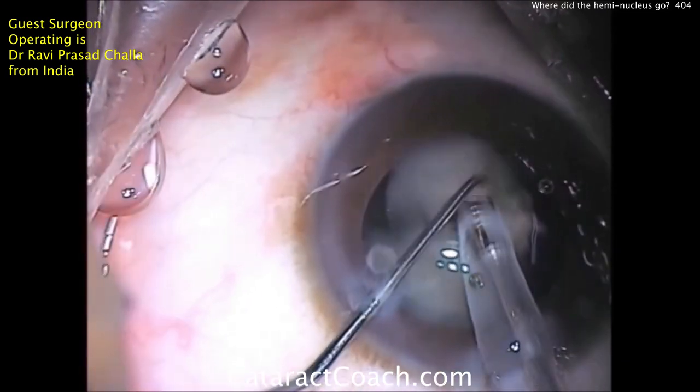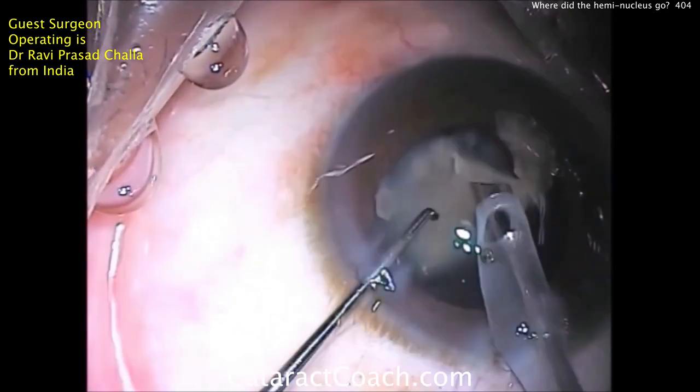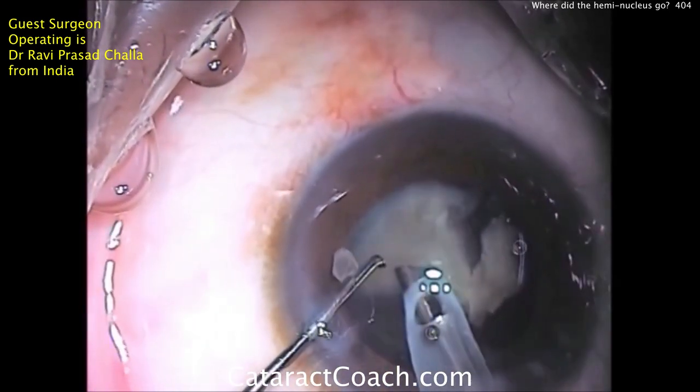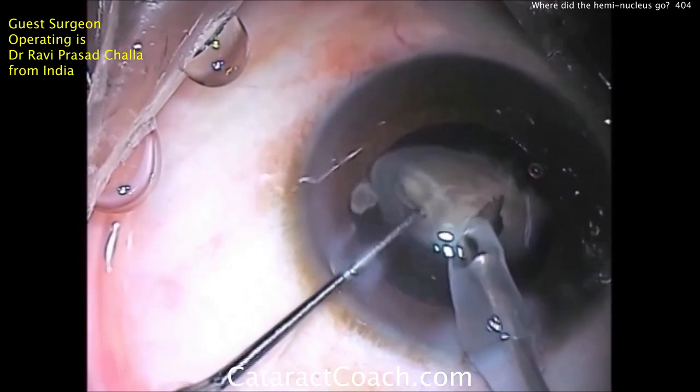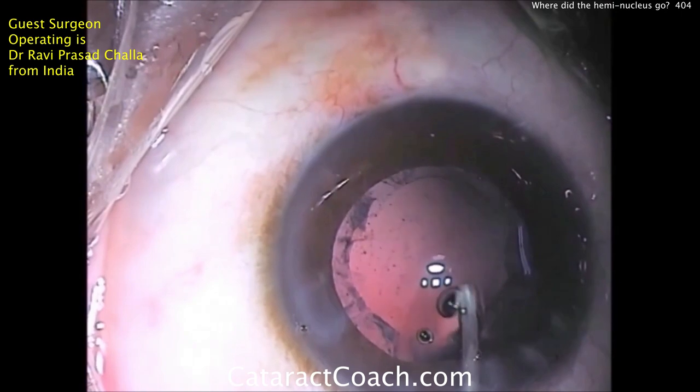Very unusual case. To have a break or a violation of the capsular bag at the equator is very unusual. I'm very thankful to Dr. Challa for sending this case, because this is something you don't see very often — at best, once every few thousand surgeries.